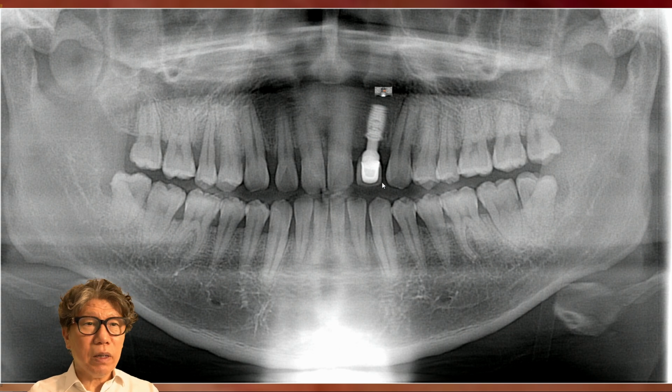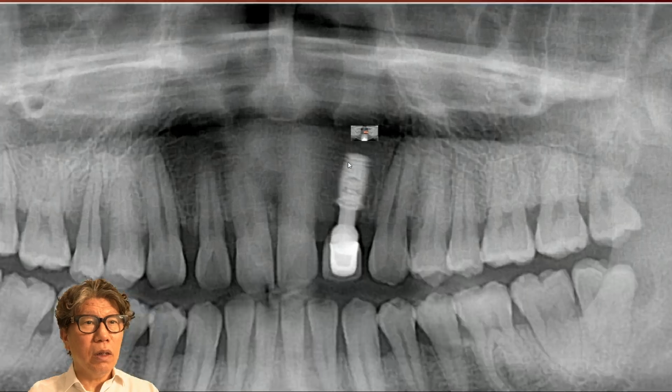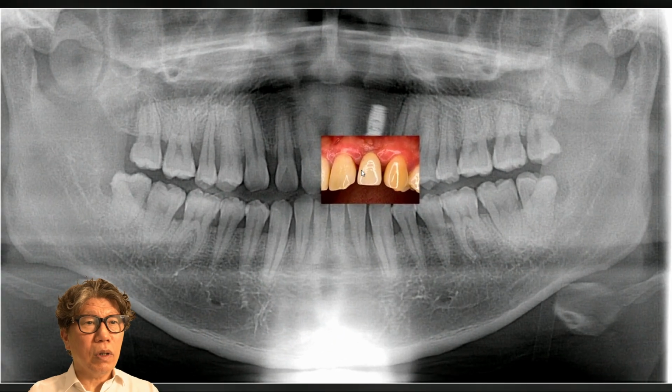And when you fill the space, it widens. So, when you explain to the patient that this side is lifted, and you will also lift this side a bit, the patients are very pleased. It's an obvious issue. So we created space in this way.